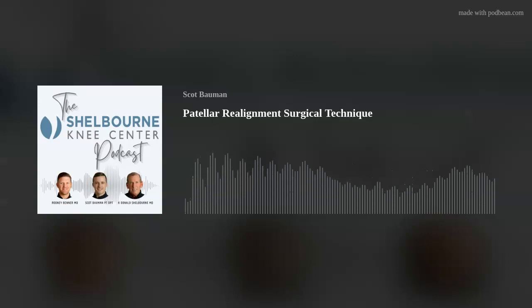And we do those again in lag screw technique on the tibial tubercle fragment, where we over drill the proximal cortex to make sure we get good compression across that fracture site. And once we started doing that, I felt like patients were much quicker to be able to have leg control and lift their leg, and we felt a lot more secure with our fixation.